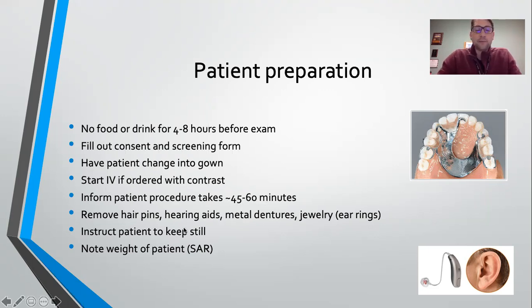It's important to remove all metal, keep still, and note the patient's weight for SAR issues. It's also important that you sometimes go over breathing instructions and have a general game plan and an idea of how the patient breathes before you get in the room, because they might freak out a little once they're in the bore. Maybe have them do a trial run and say, take a breath in, but don't overexert yourself, just a normal breath in and then release it, so that they have consistent breath holds. That's the key, consistent breath holds, because you want the top of the liver to be at the same spot each time.